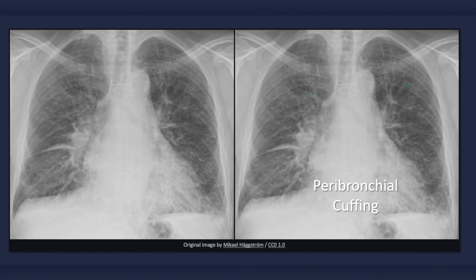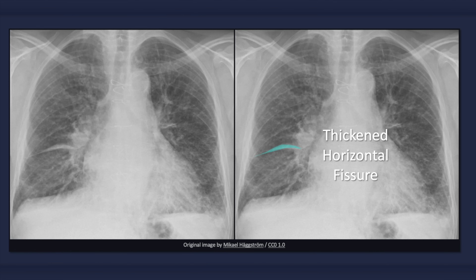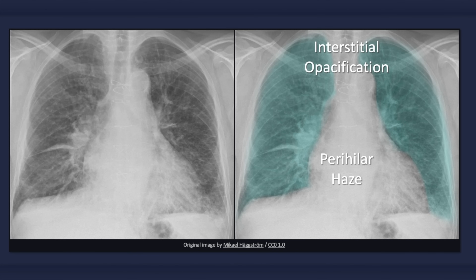Peribronchial cuffing is another discrete finding which occurs due to edema of the bronchial wall. When viewed head-on it appears as a donut or ring; when viewed tangentially — that is, from the side — it appears as two parallel lines resembling tram tracks. Note that peribronchial cuffing can occur in other conditions as well, such as chronic bronchitis. Also evident in this image is a thickened minor, or horizontal, fissure — a finding easier to detect on a lateral radiograph where both oblique and horizontal fissures may be visible. Collectively, interstitial edema results in widespread blurring of lung markings, producing a hazy appearance of the lung fields and hilum bilaterally.